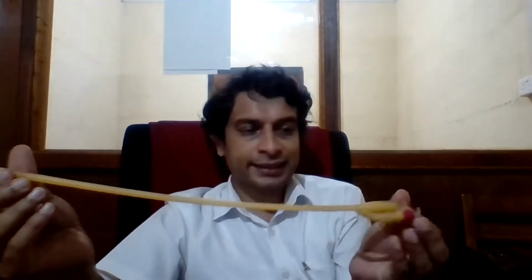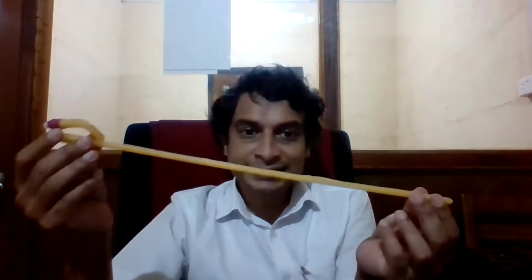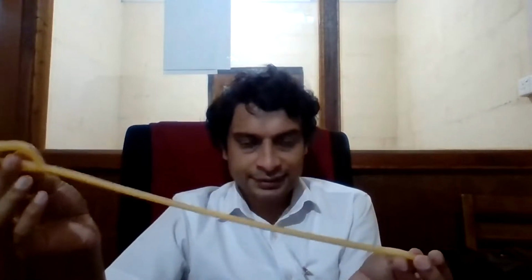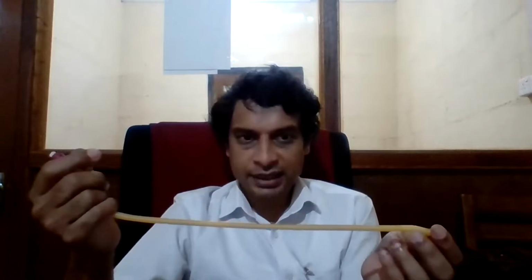So this is a Foley's catheter. This is an 18 French Foley's catheter. So this is something that you will need to practically learn how to insert into a patient in a sterile manner. That's an important task that you will need to do as an intern and as a doctor. From now on, you need to practice, all of you. By the time you finish your MSGOP, you need to have asked the interns to show you how to insert a catheter in a sterile manner in the ward.